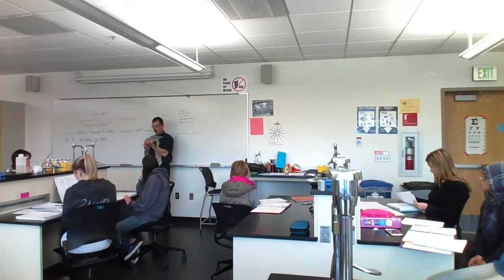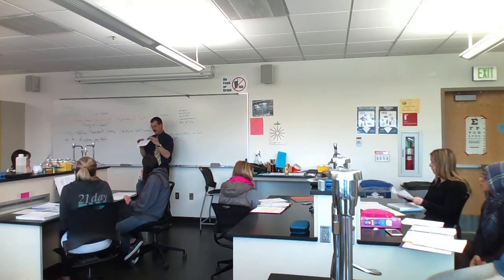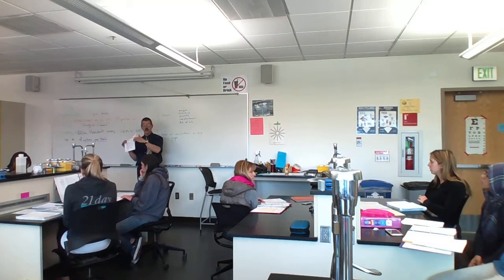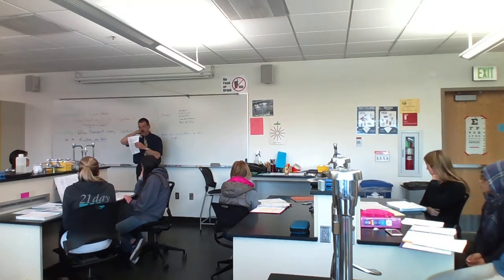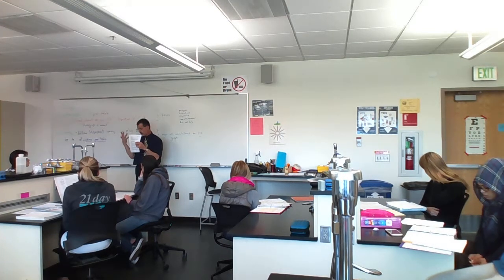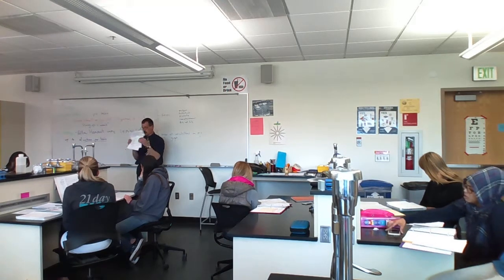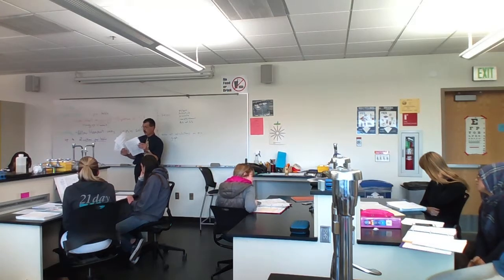But what you're going to be doing is blowing in and out of that tube. And it's going to make a graph like on the second page, like we talked about in the lecture last week. It's tidal volumes and all that. And from that, you can calculate all those numbers we did in lecture, the IRV, ERV, VC, TV, all that stuff. You can calculate on you and see how big your lungs are. It asks you to do some calculations in a table. And there's some questions on the last page.